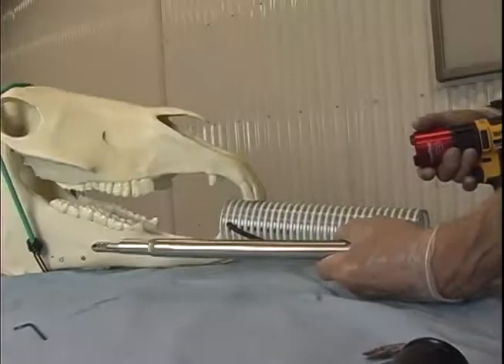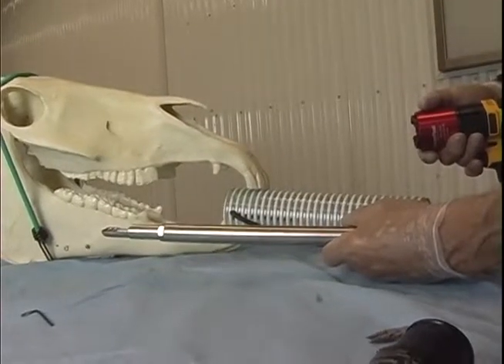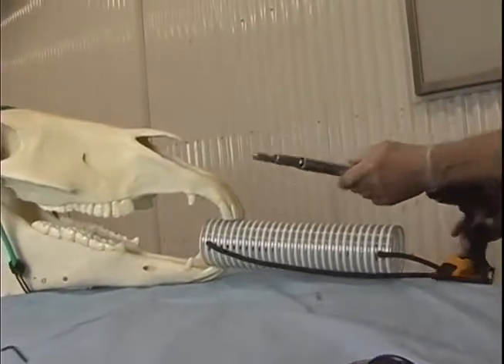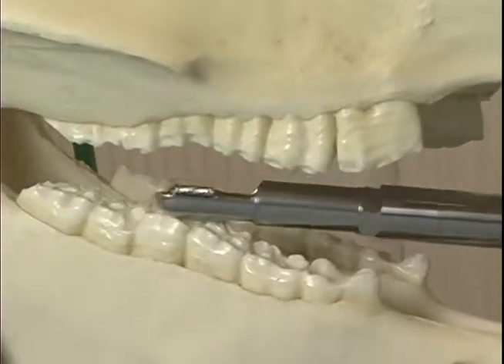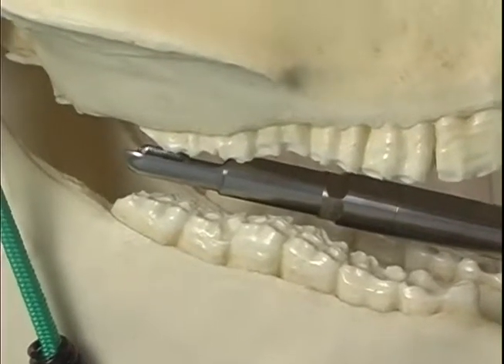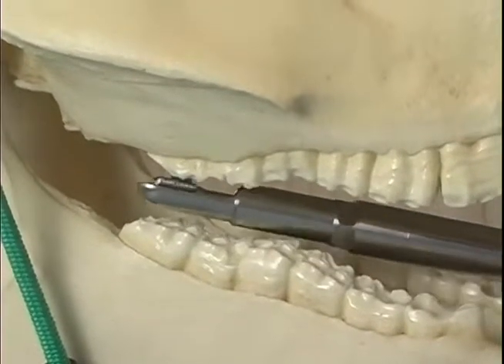This is the long rotary shaft to access the mouth in miniature horses. I would like to illustrate how you get to the back of the mouth. The shaft is introduced diagonally over top of the tongue into the opposite cheek, and the guard will push the cheek out just enough that you can float off the sharp enamel points on the outside of the uppers.